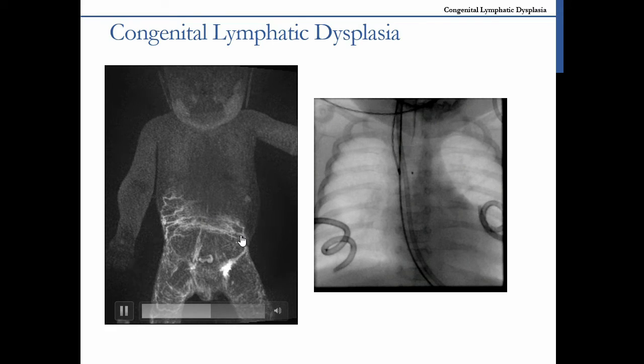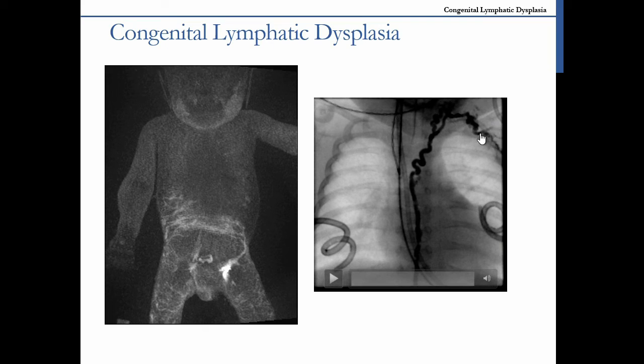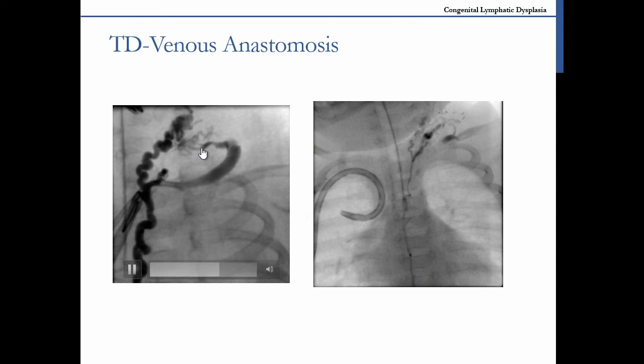But this is our new solution. This is a kid that was born swollen as well, and you can see when you do MRI, nothing goes into the thoracic duct, but when you inject selectively inside the thoracic duct, you realize that there is no communication between the thoracic duct and the subclavian vein, or maybe a tiny one here, which you may see a bit later, but most of the contrast goes to subcutaneous tissue. Fortunately for us, we have amazing endovascular microsurgeons, so we were convinced to do a lymphovenous anastomosis. Is it a good one? Absolutely not. Horrible one. But it's our first experience.